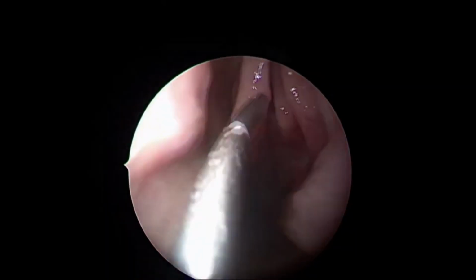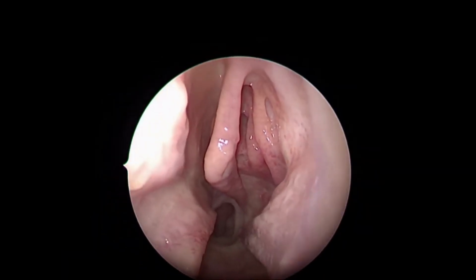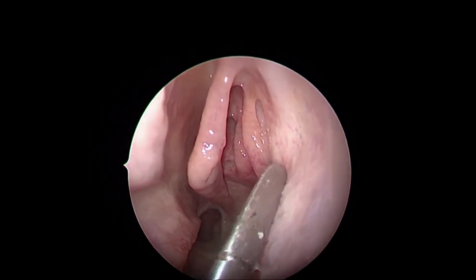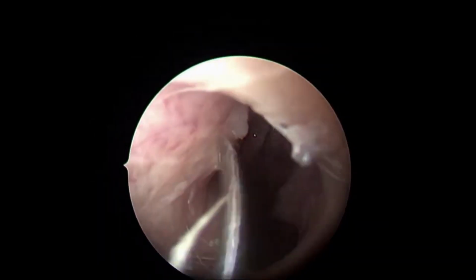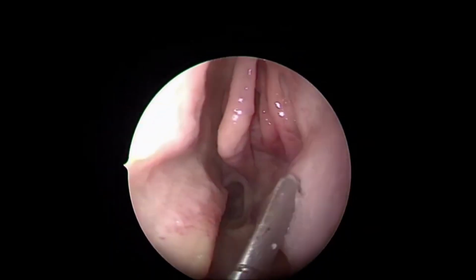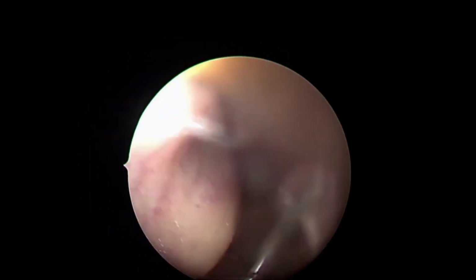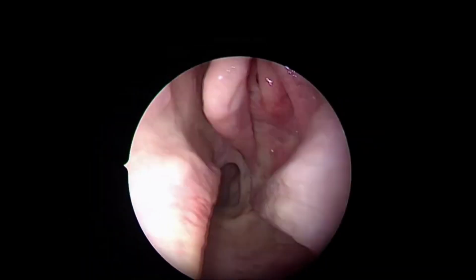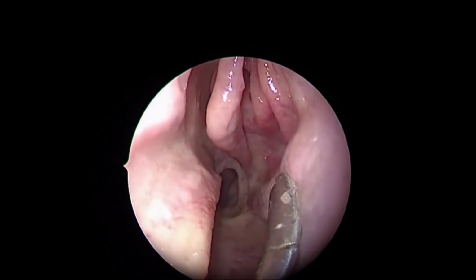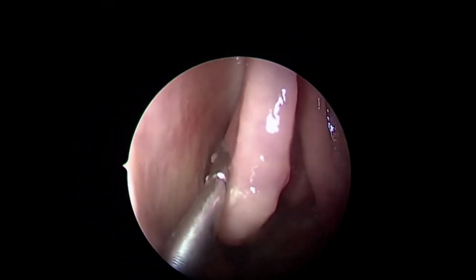On the right side, for the sinus surgeon, the key area of interest is in the lateral wall of the nose. This lateral wall anatomy is important to understand for every sinus surgeon. And to begin with, on this endoscopy, I'll just enumerate certain landmarks. So in the lateral wall, there are certain protuberances, certain depressions you can see all over. So this first structure in the lateral nasal wall, inferiorly, to begin with, is the inferior turbinate. You know, there are certain turbinates, prominences in the lateral wall. This is inferior turbinate, this is middle turbinate, and above that is the superior turbinate.